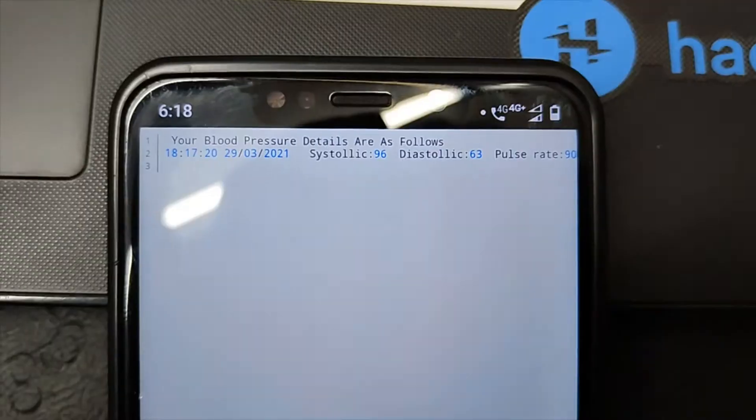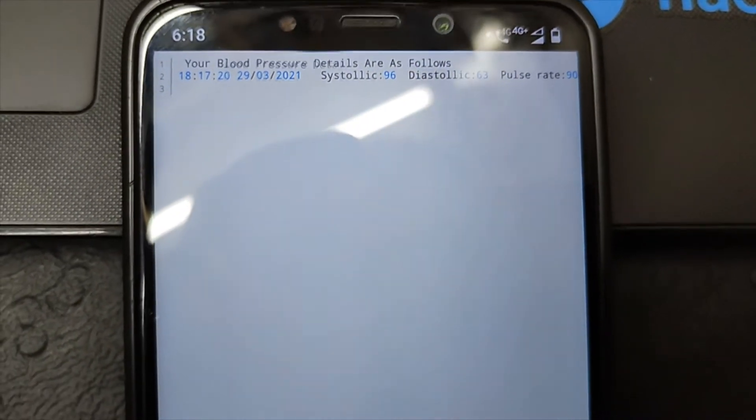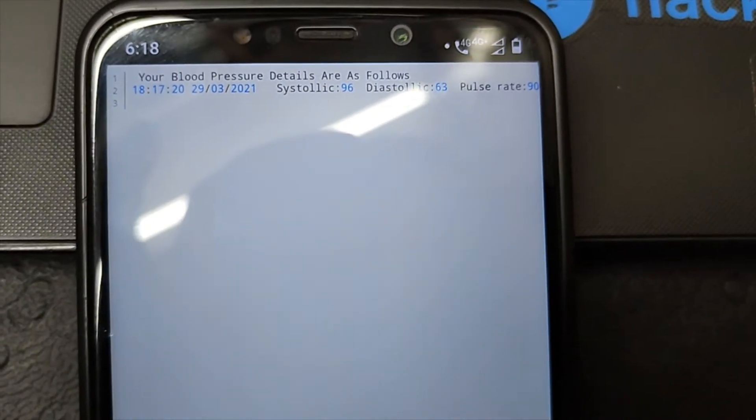The report includes systolic, diastolic, and pulse rate details in text format. The file has been sent by the Raspberry Pi.